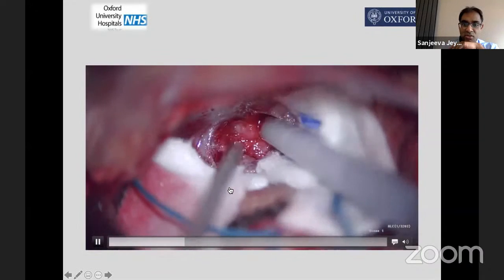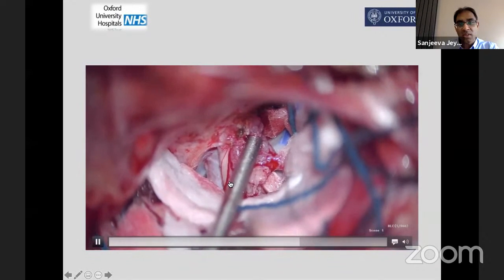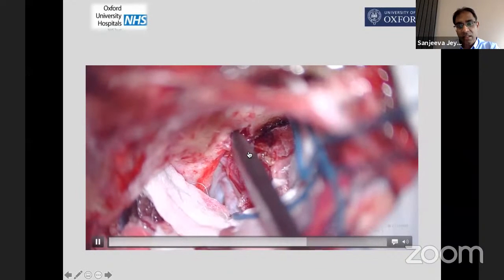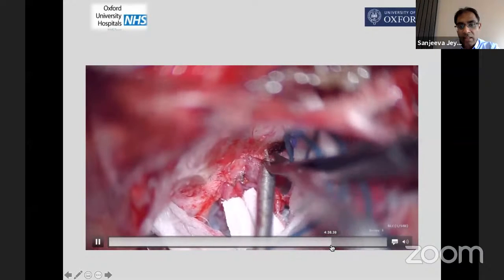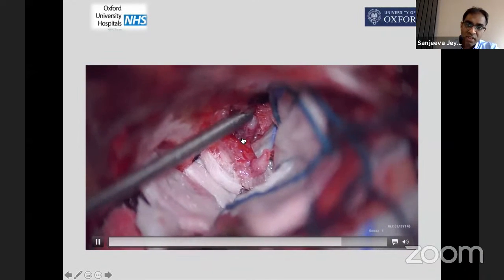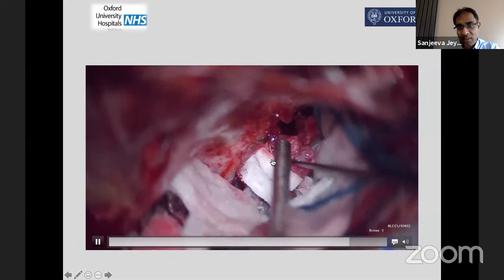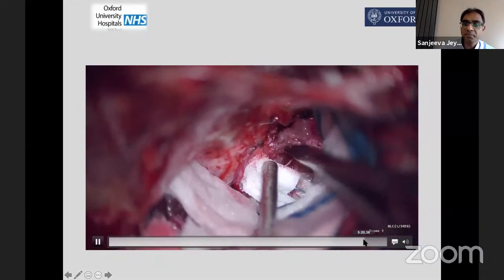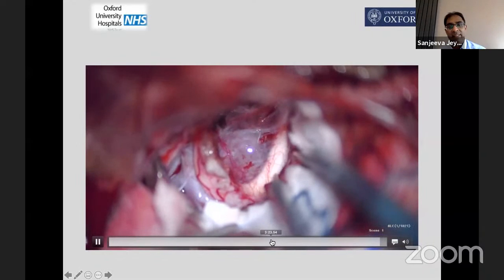Drilling a bit of the canal and widening the opening — in juxtasellar meningioma management, always always open the canal. This usually gives you a nice plane to work forward, with two areas where you can work. You can really work tumor off the nerves. I leave a small residual at the end — tumor that came from within the canal always has nice planes. As you come further back the plane can be more difficult, but you can gently work tumor off and get very nice resection. At the end you get a beautiful view of the chiasm — a very nice approach.